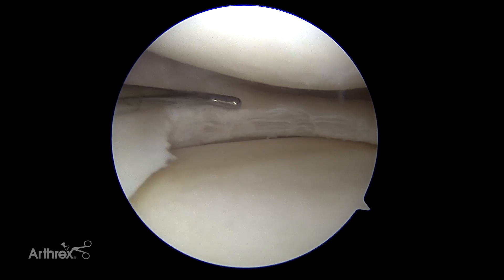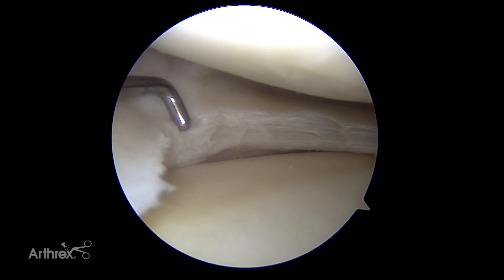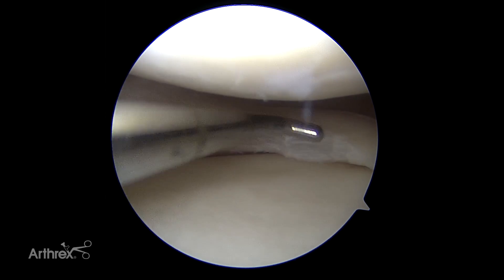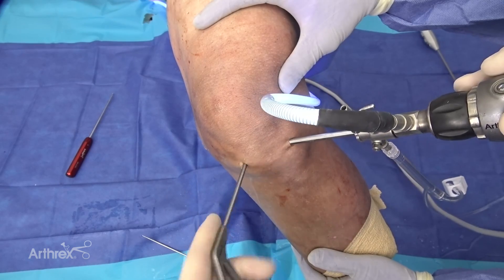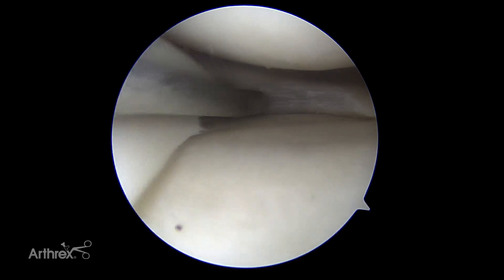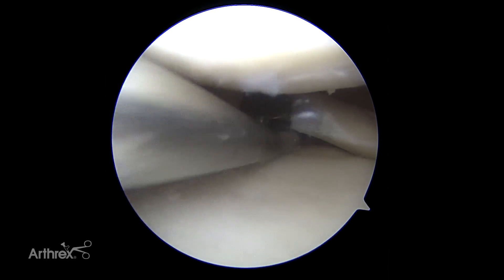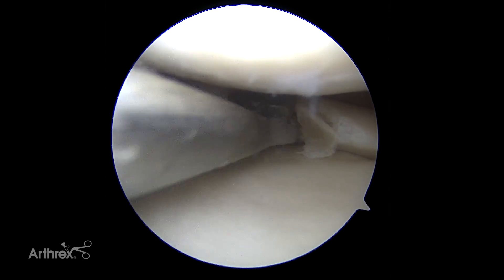The first order of business is to prepare for the allograft segmental transplant. I like to remove much of the native remaining meniscus back to about a millimeter or so for the meniscal sites to help regrow into the allograft. So first we're going to prepare this rim — coming in at the area of the tear, back toward the capsular attachment, removing the remaining meniscus. A millimeter or two to the rim is what I like to do. Then we'll prepare the rim with a rasp to further enhance incorporation of the allograft.